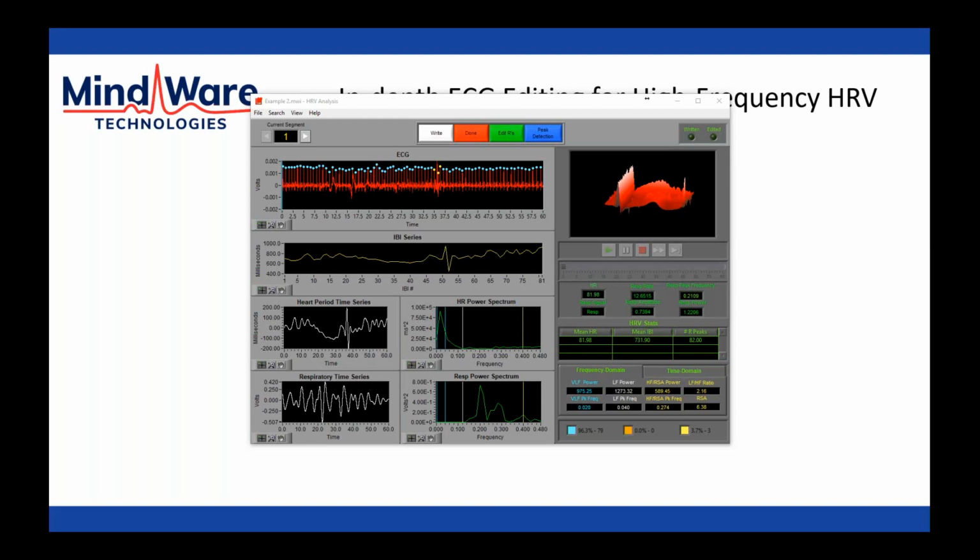For things like impedance cardiography, I'll just mention it since I just mentioned it earlier. You can offset it to the left or to the right of those really hairy areas and hopefully get better electrode adherence. Beyond that, obviously some labs will be able to get IRB approval to shave the participants. You might have more trouble recruiting if they know they're going to get shaved, so keep that in mind. But there should be, I would imagine, ways to, with ECG, get clean recordings even in the presence of body hair.